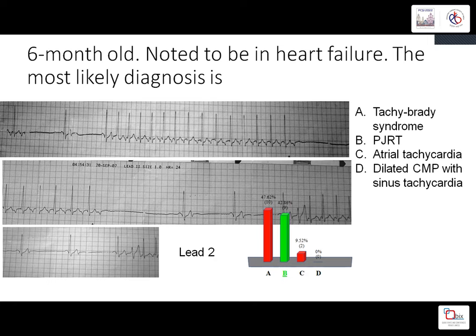Generally, atrial tachycardia will not terminate with a one-to-one relationship. A flutter can terminate, but with two-to-one and so on. But if atrial tachycardia terminates, that means the focus terminates and the AV node is also blocked. Two concurrent, unrelated events happening together is generally not possible, unless it is related to vagotonia or adenosine, or in a 2-to-1 relationship tachycardia, atrial flutter.